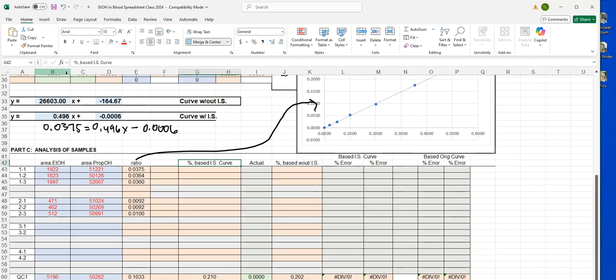All right. So in order to calculate the percentage based on this setup, I need to input some numbers. And I need to be careful with how I input them here. If it makes you feel a little bit better, we can keep the plus and we can put a negative here. That works. I mean, that's how it is in Excel spreadsheet, so why not?